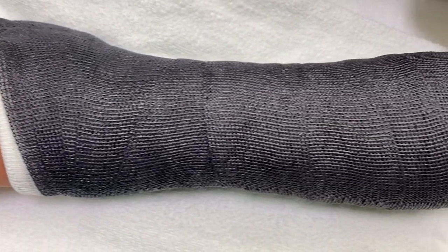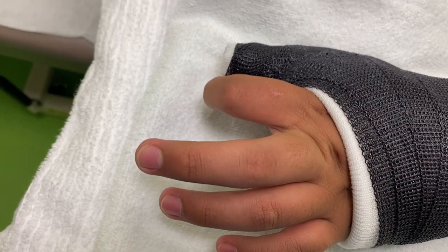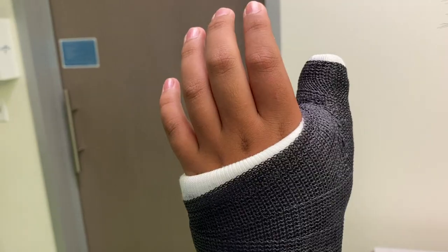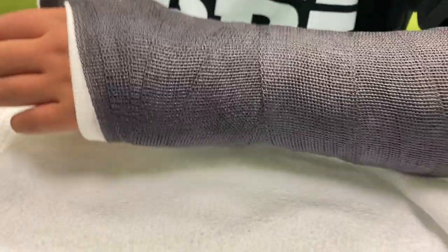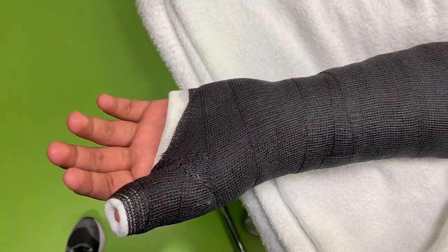Up next we have a short arm thumb spica cast, and this boy got his thumb jammed while playing football. He was unfortunately complaining that the cast was too tight, but I always tell my patients that the cast will always feel a little bit snug and they have to give it a couple of hours — even days — for it to loosen up a little bit, but not to the point where the cast will slide off.